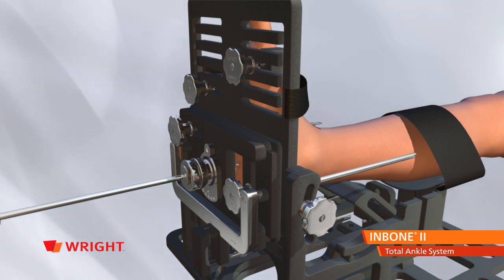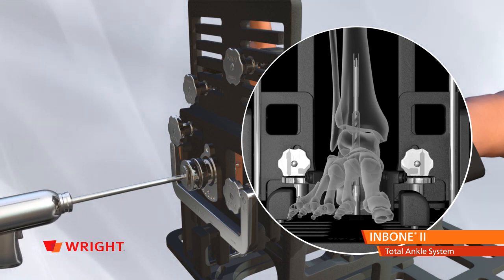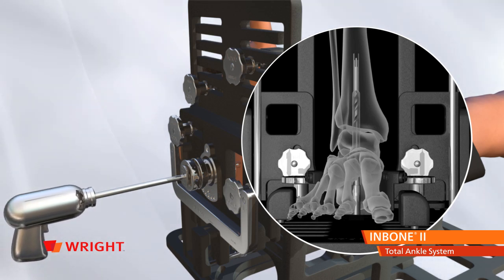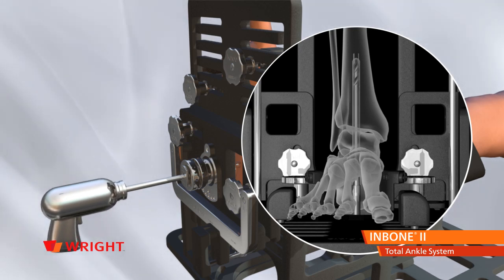Begin to slowly peck drill into the calcaneus. This should take at least three minutes if properly done. As you peck drill, periodically confirm under fluoro that the drill advancement is in line with the AP guide rods. Continue peck drilling past the cortical bone of the tibia and advance into the intramedullary canal approximately 6 to 9 centimeters. Leave the drill in place.